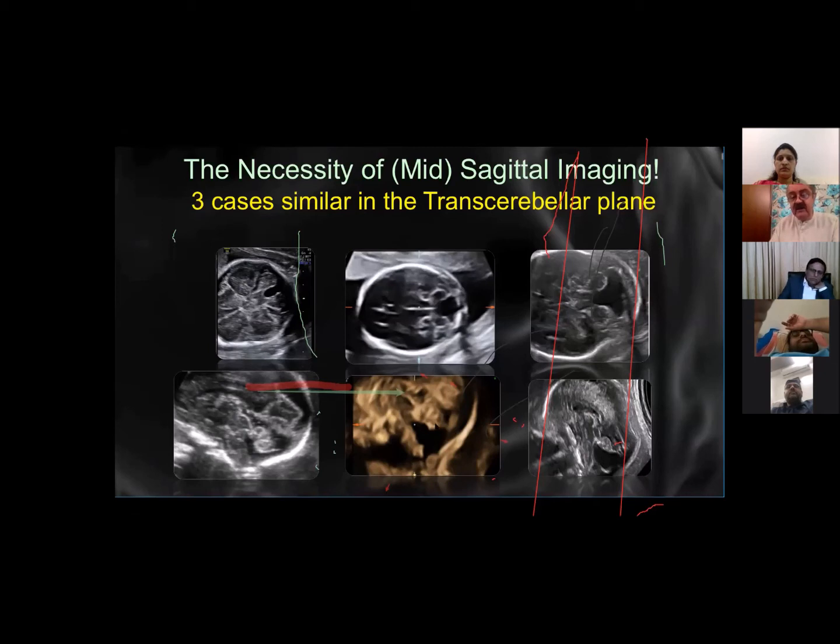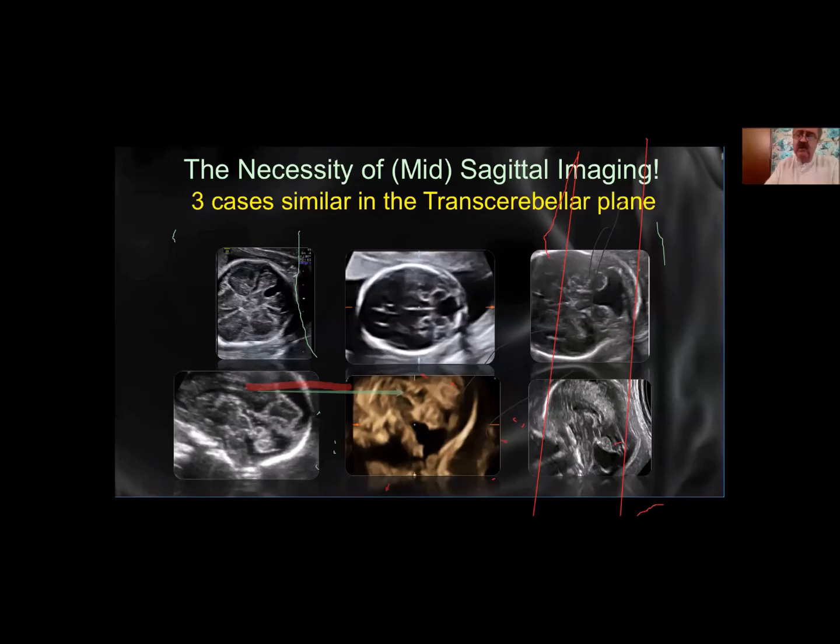In this one, I don't see a nice globular cerebellum. Part of the vermis is missing, a larger communication. So I know that this is vermian agenesis, and 50% will do badly and 50% will do all right. And if I have an upturned small cerebellum in a large space here, then I know I'm looking at Dandy-Walker, where 90% of them will have a poor quality of postnatal life, and therefore I can prognosticate immediately and tell them there and then.